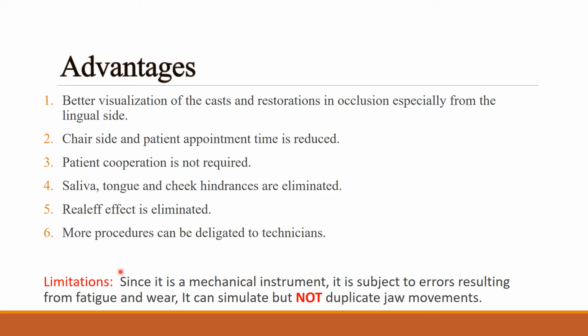So coming to the limitations, since it is a mechanical instrument, it is subjected to errors resulting from fatigue and wear. It can simulate but not duplicate the jaw movement. Yes, so simulation and duplication are two different things. So yes, we are just trying to simulate the jaw.